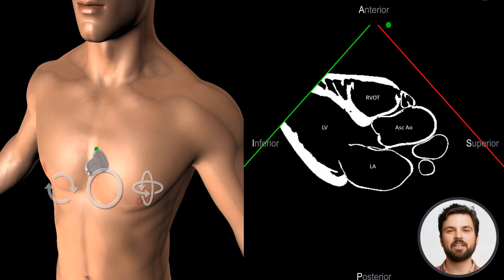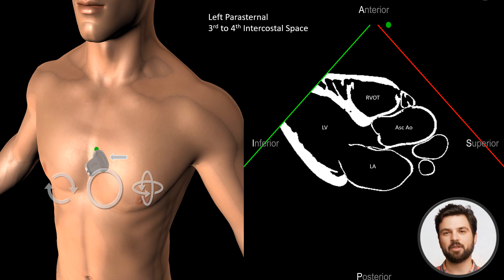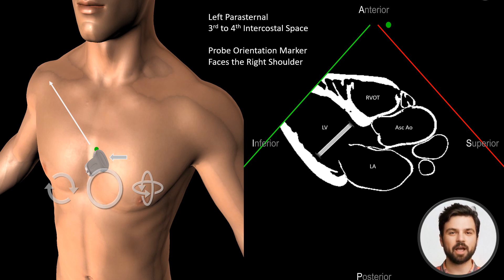The first view that we will look at is the parasternal long axis view. To obtain this view, we first place the patient in the left lateral decubitus position with the left arm under the head. Identify the third or fourth intercostal space just to the left of the patient's sternum. The probe is placed in this position with the marker facing the patient's right shoulder. Make small adjustments to the probe position until the two opposite left ventricular walls appear at their widest distance.